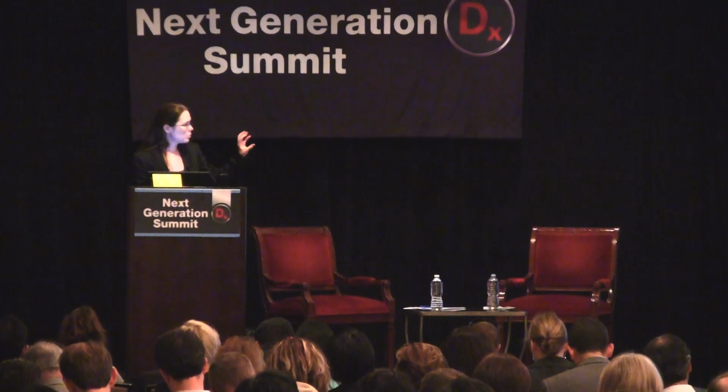And these are what I'm going to use as the case study, the example of how FDA regulatory review proceeded and the kinds of questions we asked. I'm not going to focus on the NGS platform and reagent kits other than to say the NGS platform was cleared as class 2 exempt with special controls, and the kit reagents were class 1 exempt.